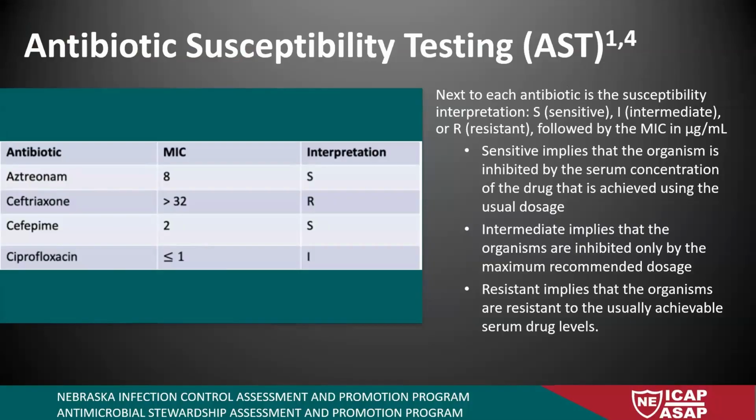This is also an example of a different look of something that shows you that it is a carbapenemase producing organism. This result shows, like it says, microorganism agent. It says it could be a Klebsiella oxytoca. And it says this isolate is positive for a KPC carbapenemase. And they always put it in like red. And they tell you an infectious disease consult is recommended.